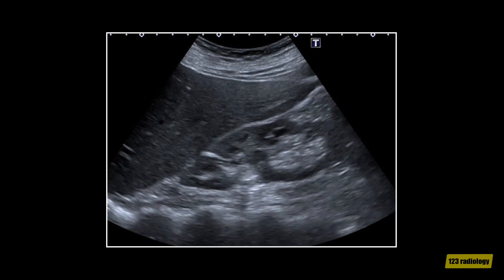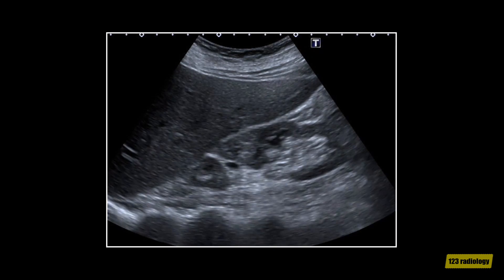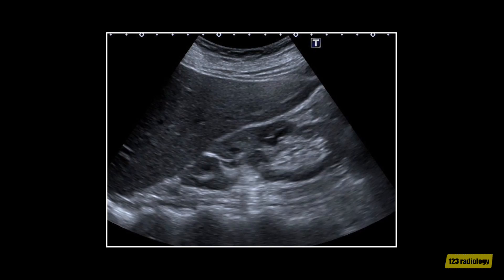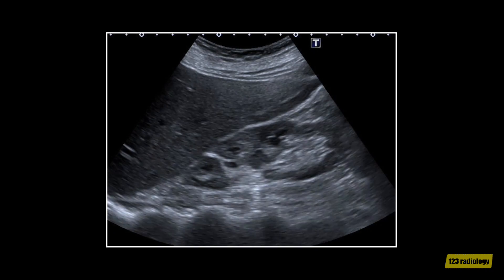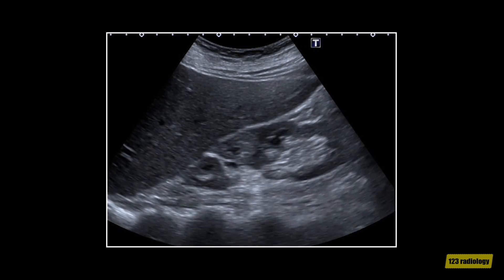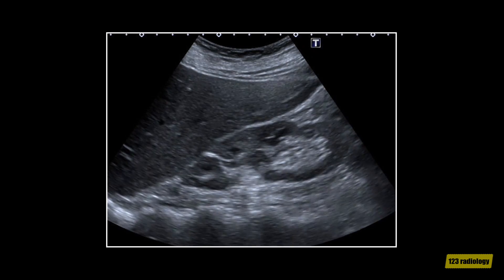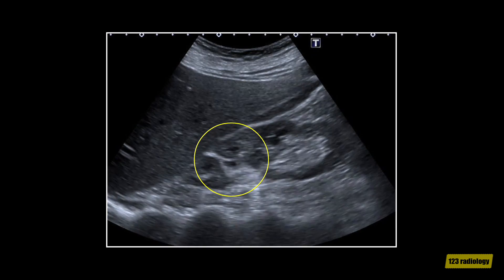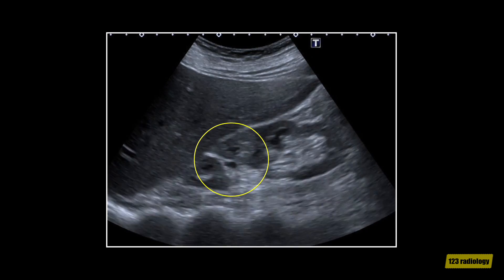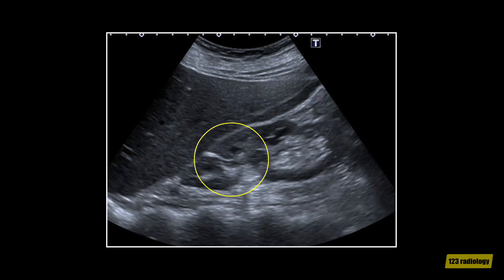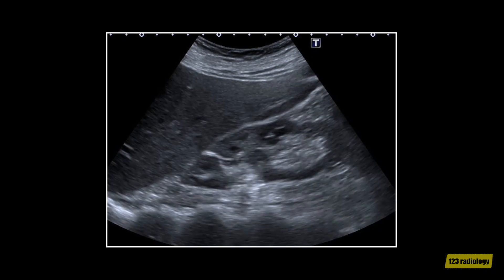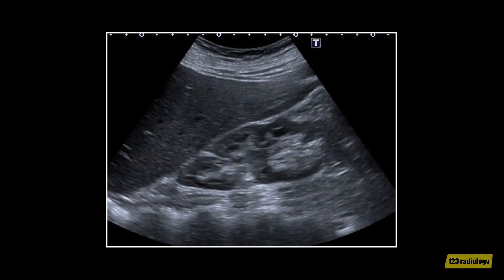This video clip shows another case of junctional parenchymal defect. This is a longitudinal view of the right kidney. It shows an echogenic line extending from the anterosuperior aspect of the kidney into the sinus fat. Again, this is a characteristic location for a junctional parenchymal defect.